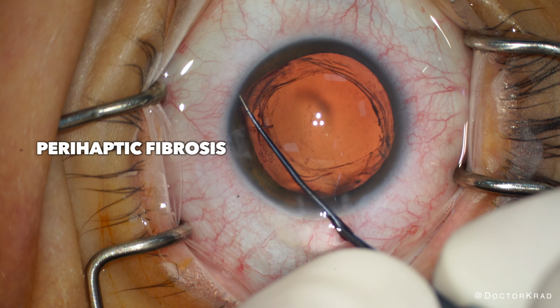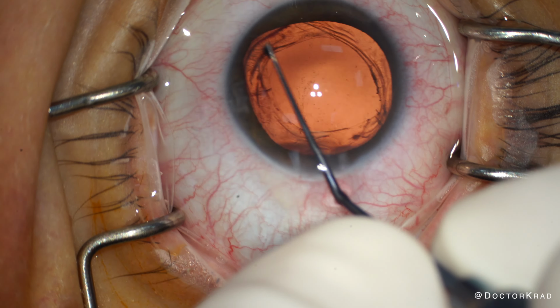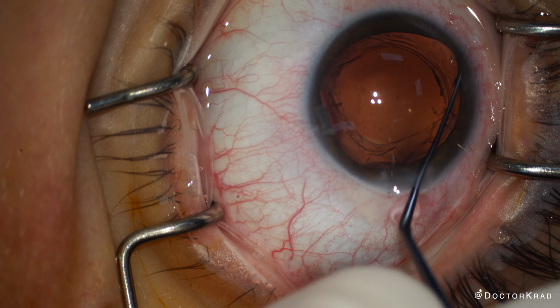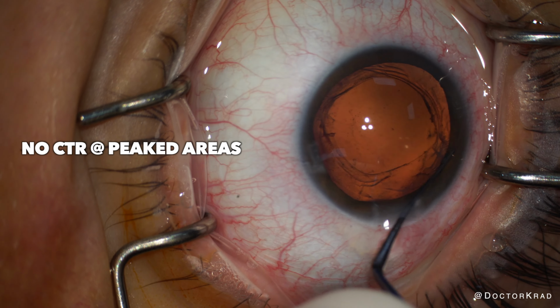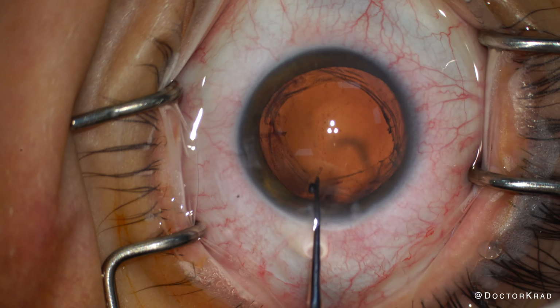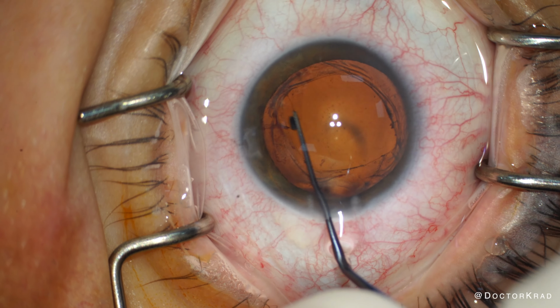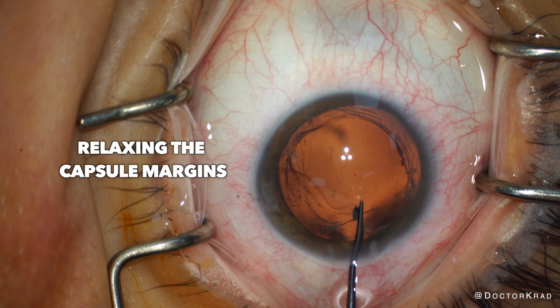I think for a second, is that the CTR? But that's just the fibrotic capsule that encased the haptic. The pupil dilates really well, but I'm using my Kuglin hook to give me max exposure. I'm pushing the iris all the way back, essentially to its root, all the way to the limbus, but I don't see the CTR. I'm using my second instrument to massage the edges of the capsule just to see if I can relax those folds and make it more round.